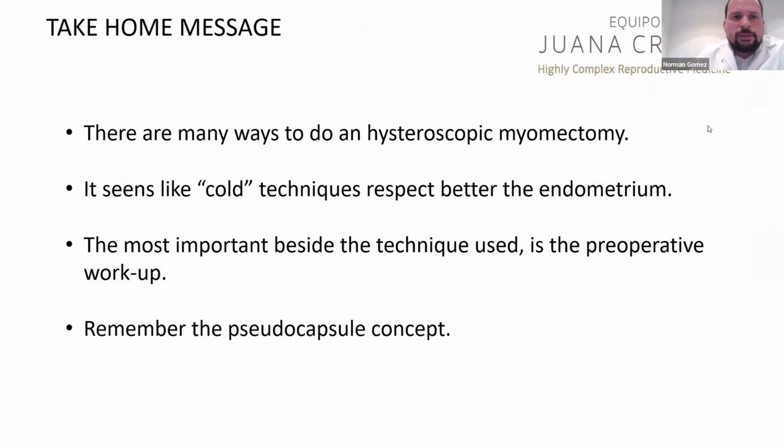So to conclude, there are many ways to do a hysteroscopic myomectomy. It doesn't mean that one way is better than the other, but the one you develop, you need to master and train very well to have good results. It seems that the cold techniques respect the endometrium better.